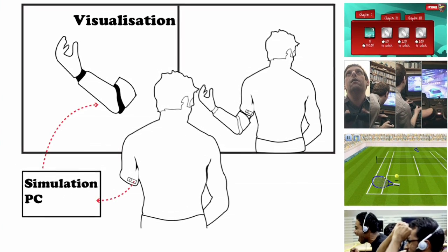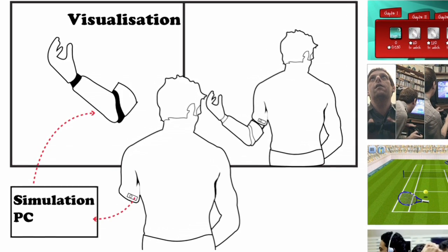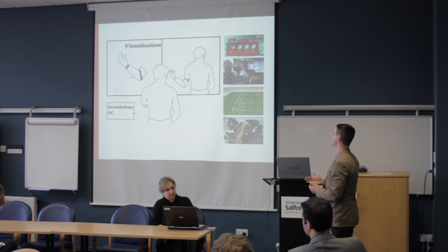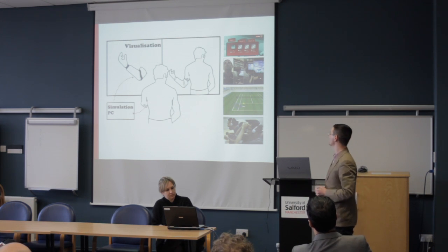And what we would like to do is bring in those elements from the psychology literature about what makes games motivating, to make this more than just a simple training tool, but actually something that's enjoyable and engaging in its own right, to encourage the prosthesis user to persevere with the application. It's probably worth pointing out that none of the people involved in the project so far actually have a background in developing games. So what we really hope by bringing this here is to get some feedback on how these sorts of ideas could be instantiated into an engaging and useful application.